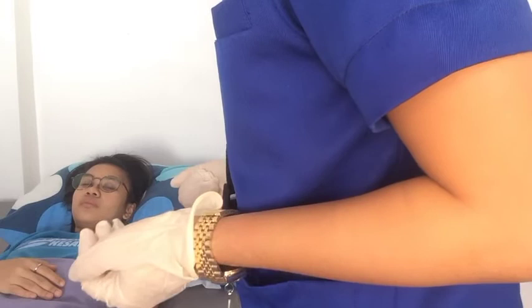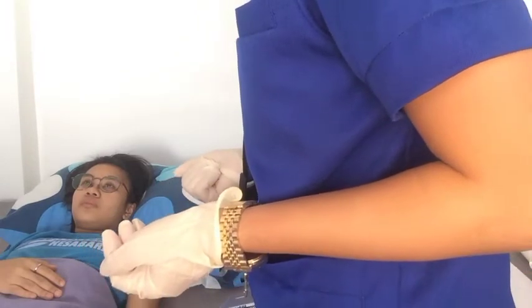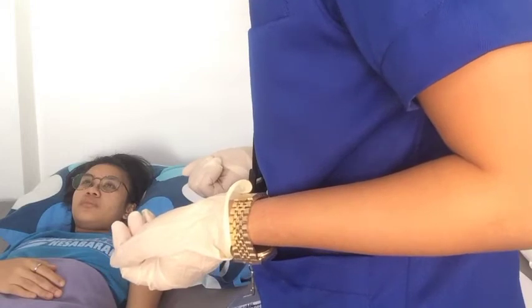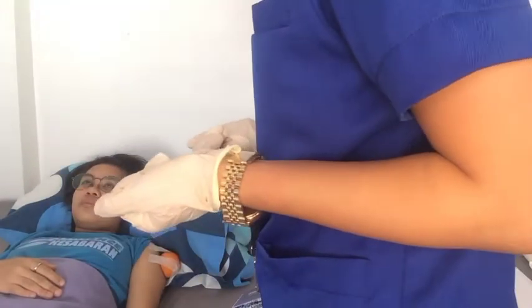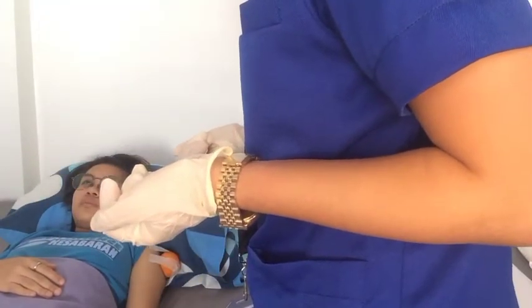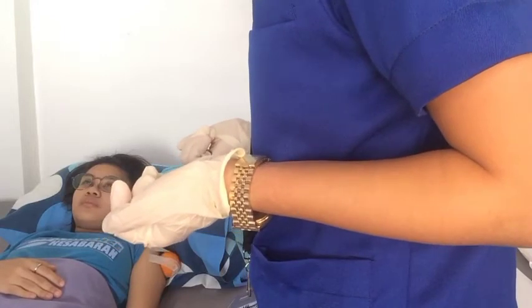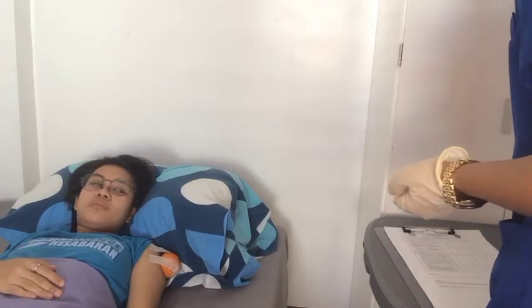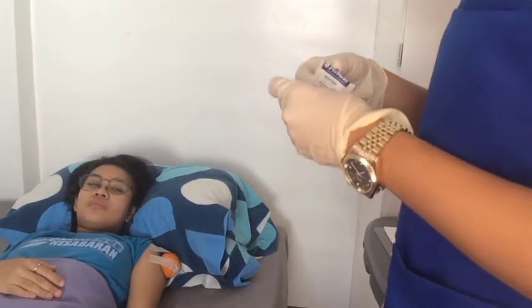If injections are to be frequent, alternate sites, avoid using the same site twice in a row. Locate the exact site for the injection, put on clean gloves, and clean the site with an antiseptic swab using a circular motion. Start at the center and move outward about 5 cm, 2 inches. So I have here the antiseptic swab.